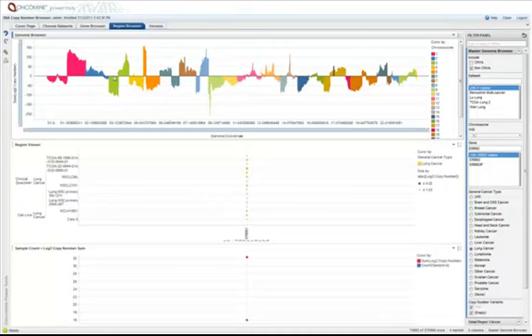And what we're doing here, somewhat like the GISTIC algorithm that you may be familiar with, is summing log2 copy number to point us to the regions of the genome that have frequent and focal amplification or deletion. So I've got HER2 highlighted here on chromosome 17. Let's zoom in to chromosome 17 to take a closer look at this region.